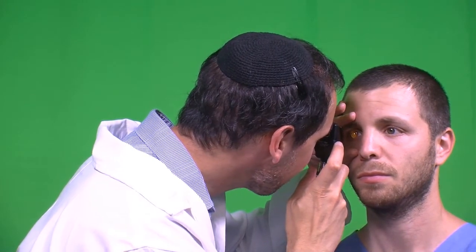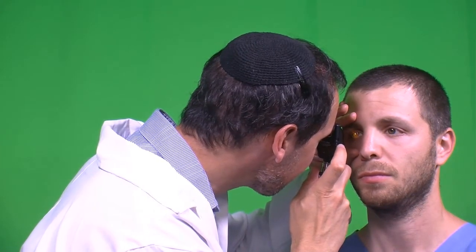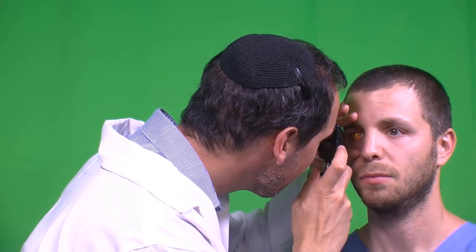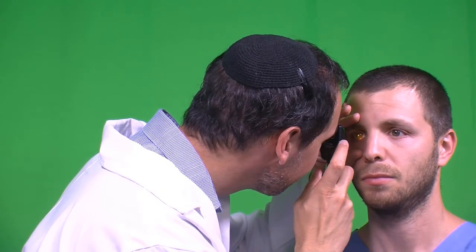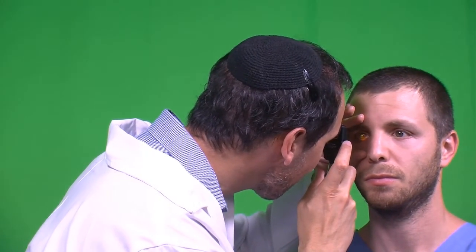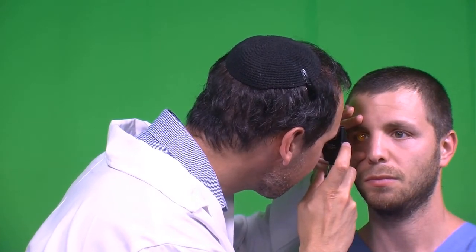Once I've done that, I'm going to now zoom in onto the fundus, onto the retina, and to do that I'm going to advance the dial towards the minus direction about 10 clicks. And as that's done, the retinal vessels will come into focus. And then I fine-tune in order to see them as clearly as I can.